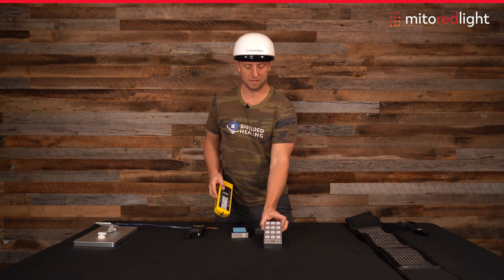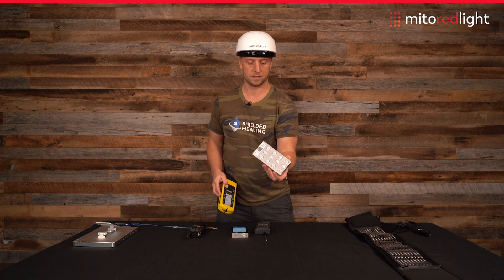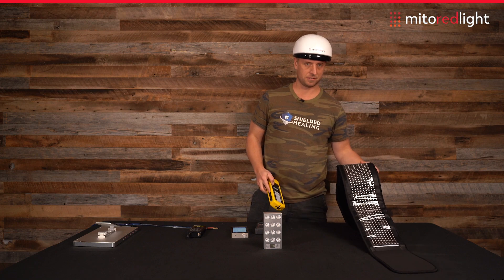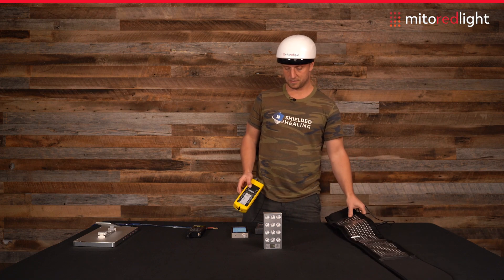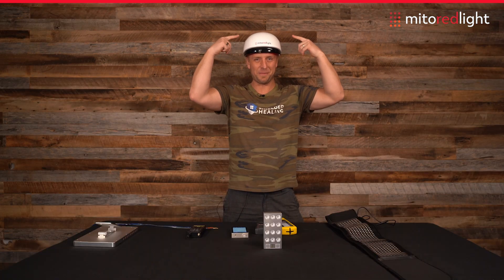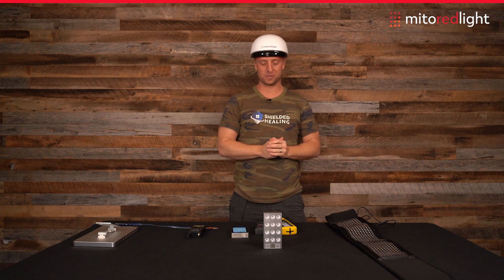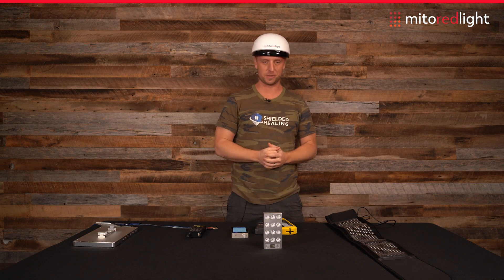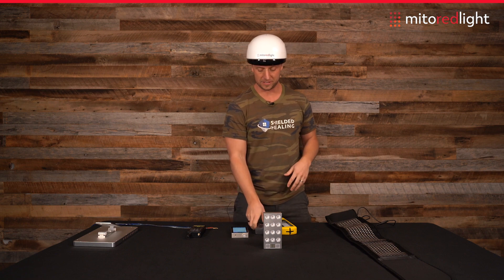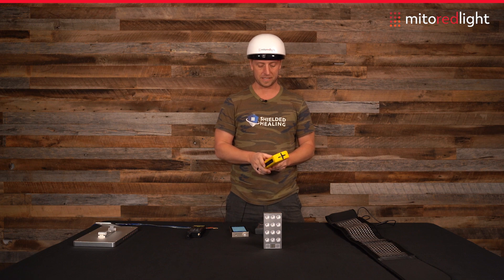We're going to be testing the Mito Flex unit — it's a portable red light therapy device — we're going to be testing the belt, and we're going to test the helmet too. We'll test it for flicker as well and electric fields, which it won't have any of because it's not AC, it is DC. So let's go ahead and start with magnetic fields.